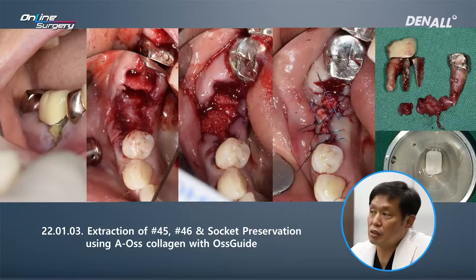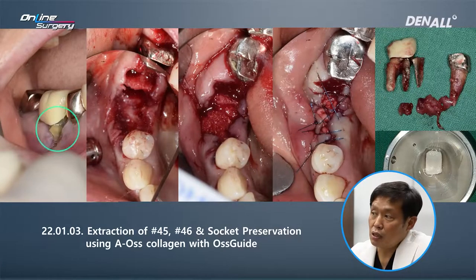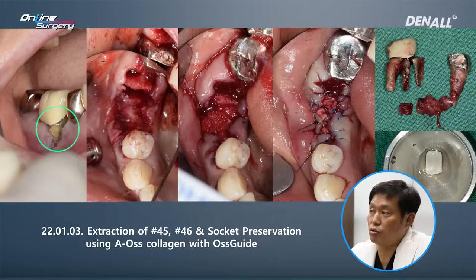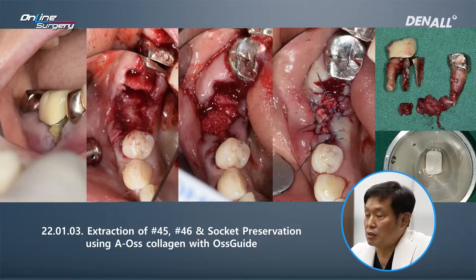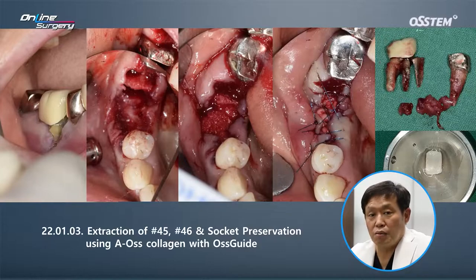In the area where the teeth are, the root is actually exposed. There was a root fracture leading to complete buccal wall destruction. AOS, a collagen membrane from Ostem, was used to do socket preservation.